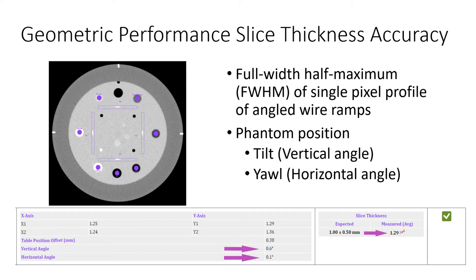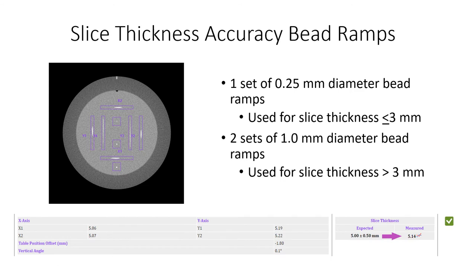Phantom rotation about the x and y-axis is estimated from the known measured slice thickness for each pair of ramps and the offset from the module center. Slice thickness accuracy using bead ramps: the measurement of slice thickness using the 0.25 mm and 1 mm spaced bead ramps in the CTP 591 module follows the same sampling method as just described for the wire ramps, with one exception that the baseline correction is modified due to the impact of volume averaging with different slice thicknesses, where the percentage of baseline correction applied increases with thinner slices. The number of peaks in the profile are counted and multiplied by the bead spacing, then converted to slice thickness using the tangent of the ramp angle.